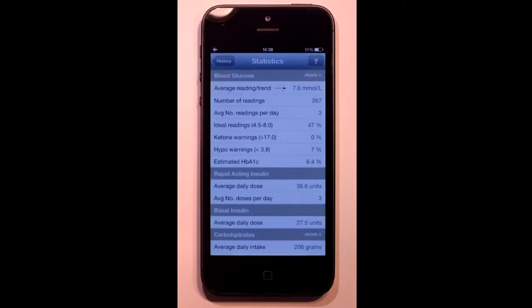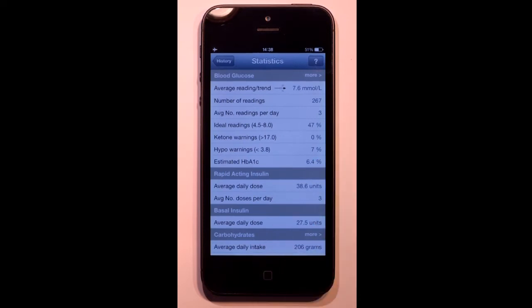And there are detailed stats, including my estimated HbA1c, to help me keep track of my progress. So next time you see your healthcare professional, you don't need your logbook, just show them RapidCalc.